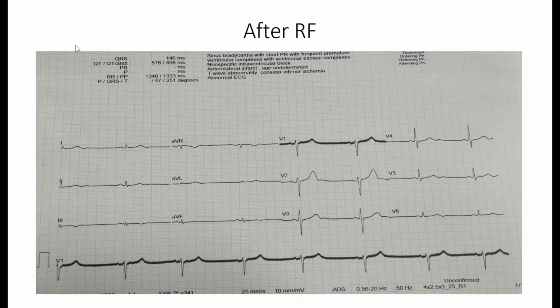But I wonder whether we needed to pace with a different sequence than S1, S2, S3. Maybe we should have done a long-short cycle like in long QT to see whether we can trigger the afterdepolarization mechanism. But I don't think those are in the clinical practice arena; they are research arena right now, as far as I know. People use isoproterenol routinely, probably yes, but I don't know whether it enhances inducibility or not. That's certainly not fully tested yet.